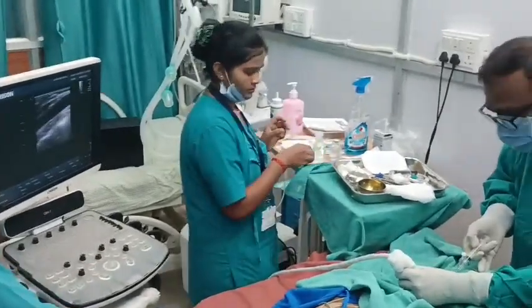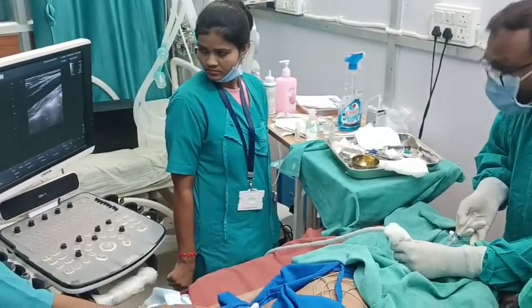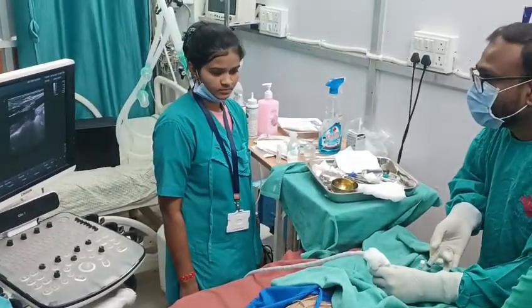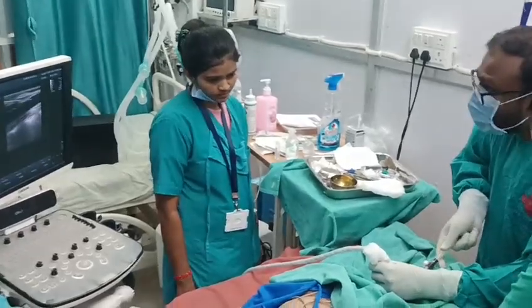This is the view. I am inside — yes, I am inside. Blood is coming out.